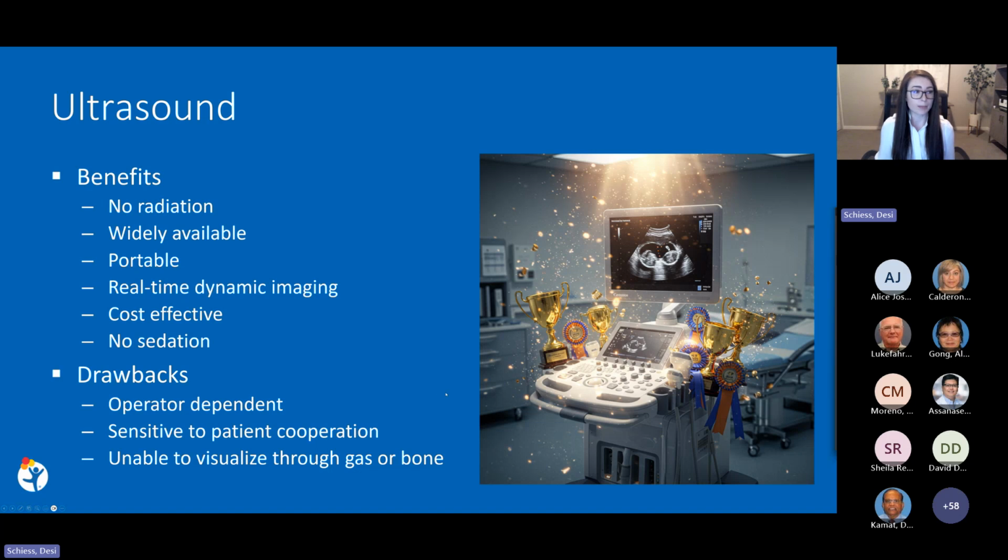Moving on to ultrasound. In pediatric radiology, we love ultrasound. Ultrasound images are created by the transmission and interaction of sound waves with various tissues in the body. Thus, there is no radiation. Ultrasound is widely available and the machines are portable, enabling bedside imaging when needed. Ultrasound provides real-time dynamic imaging, meaning we can assess in different patient positions or with the Valsalva maneuver. Ultrasound is cost-effective and does not require sedation. Unique considerations include that image quality is operator-dependent and requires patient cooperation, as well as that sound waves cannot penetrate through bowel gas or bone.